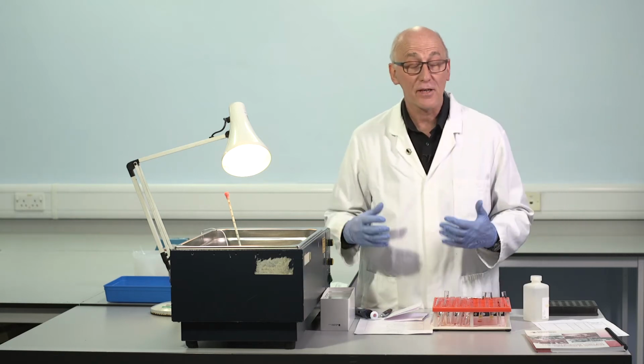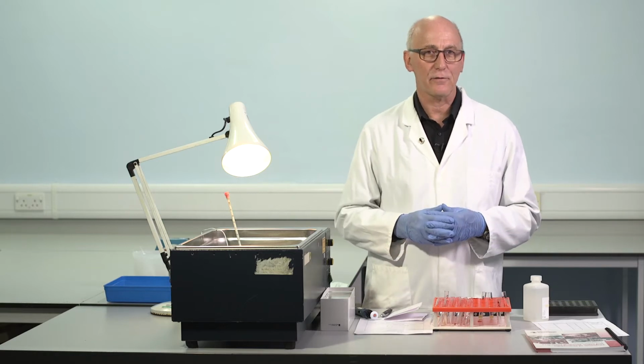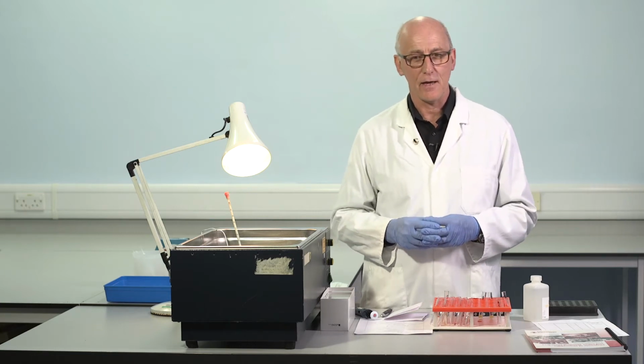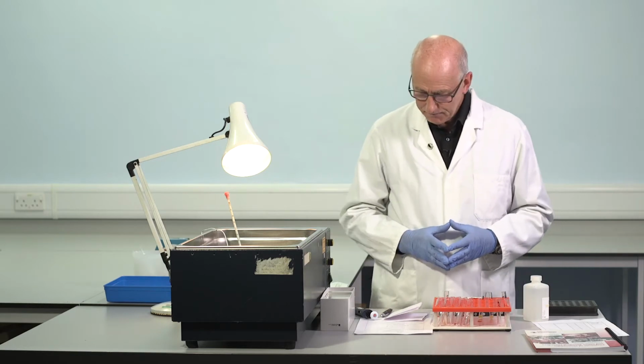So it's a false economy. Those centres who have tried to do this cite the cost of disposables as the reason. I really think it's a false economy. It interferes with the precision and the accuracy of the test and introduces an important source of error. So I really don't think it's more economic.